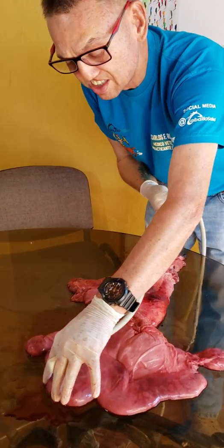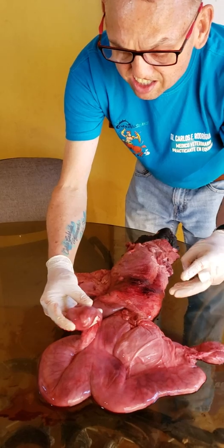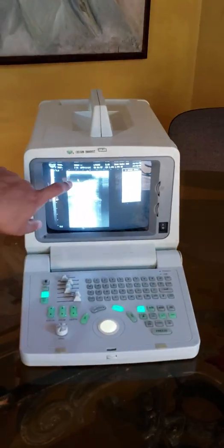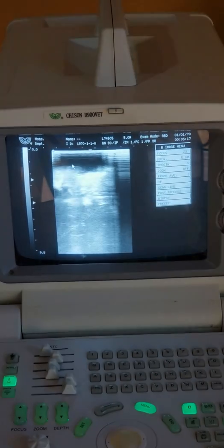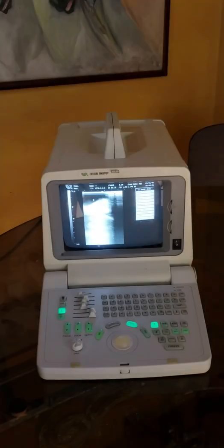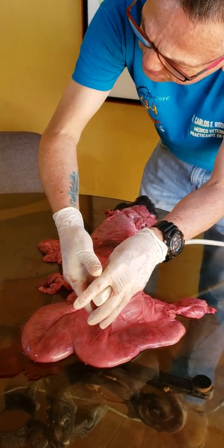Now through the horn I'm going to the right horn to check it, and I'm going to get to the right ovary. This is the right ovary, and you can see a follicle here. I'm going to touch it so you can see the liquid — liquid is always black in color, anechoic. This follicle is about to rupture. There is only one follicle — one big large follicle.